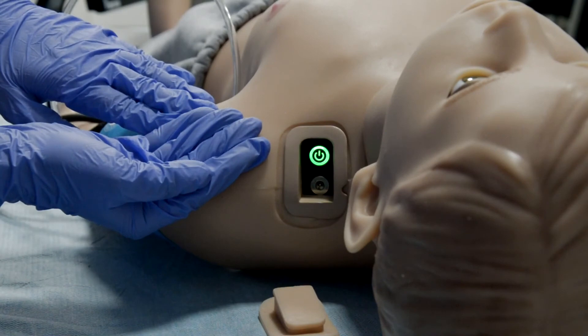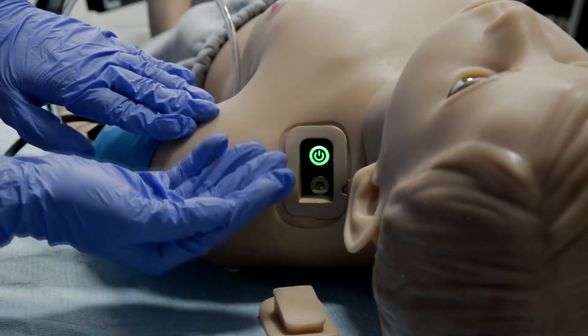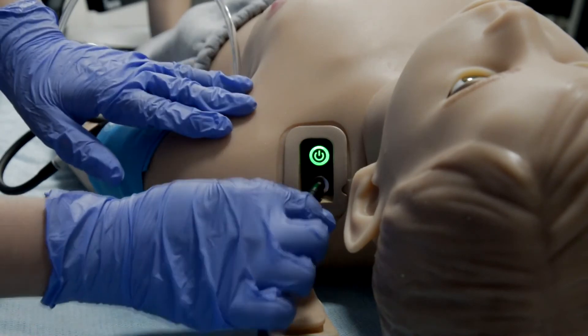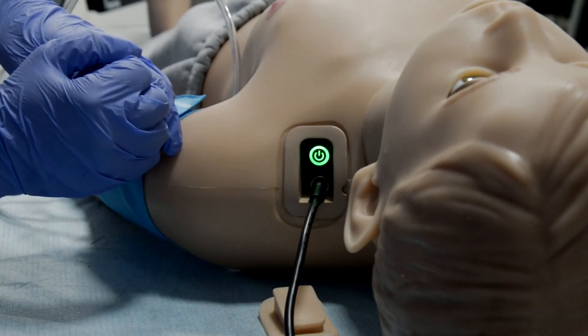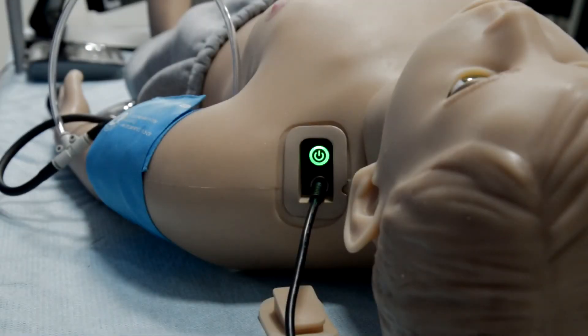While the simulator is on, the switch LED is green. Under the switch button you will see the port for the battery charger — if you need to recharge, just insert the power cord into the port. When charging begins, the switch button flashes. You can still use the simulator while charging.